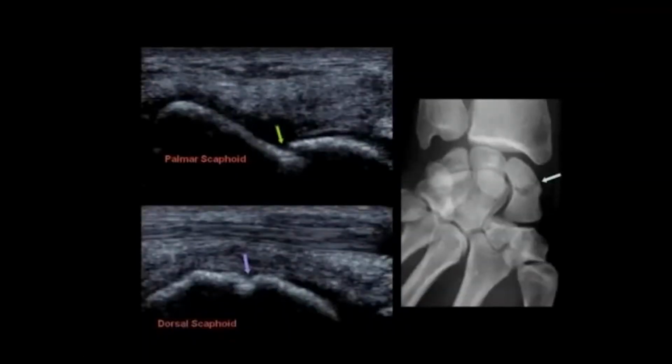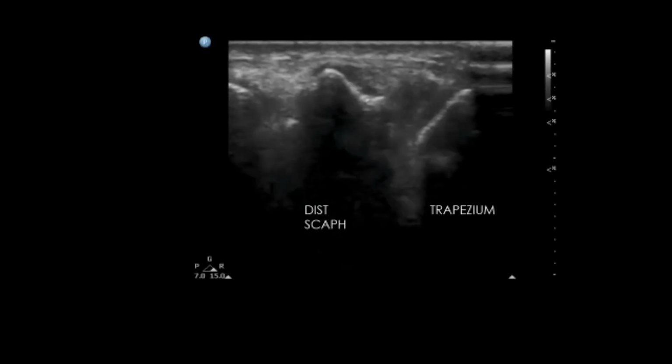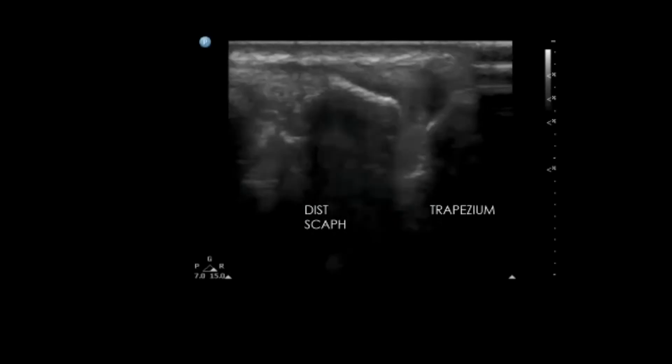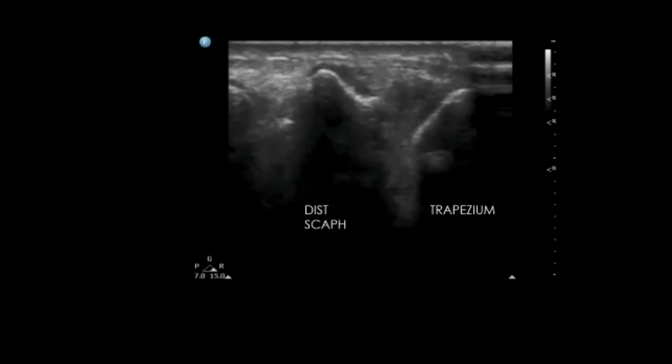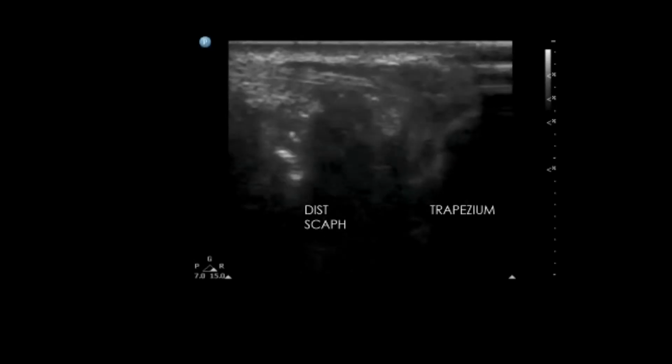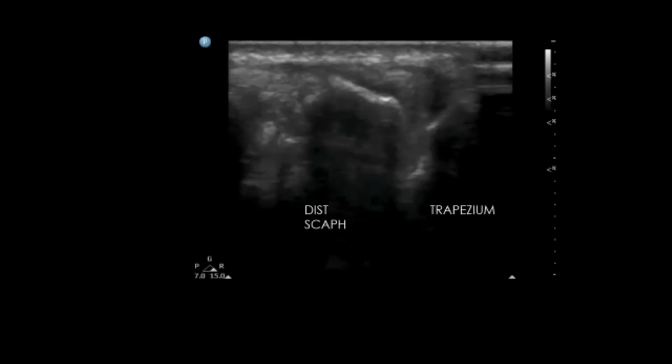So you can look at it from the palmar aspect and the dorsal aspect to see the fractures. And this is an example. So you're actually scanning, you can see the distal end of the scaphoid with that pretty large hump, and then the trapezium. And this is the patient's right side. And you can see the cortex there looks pretty smooth.